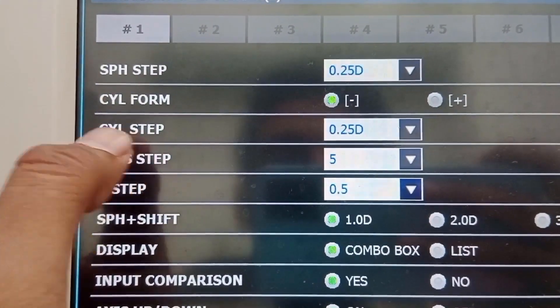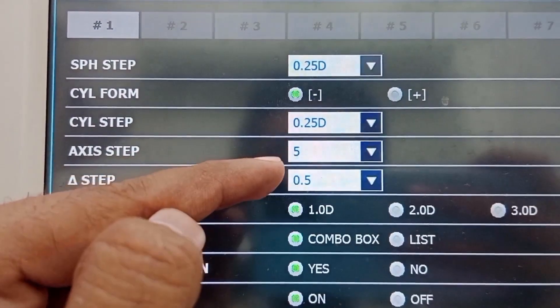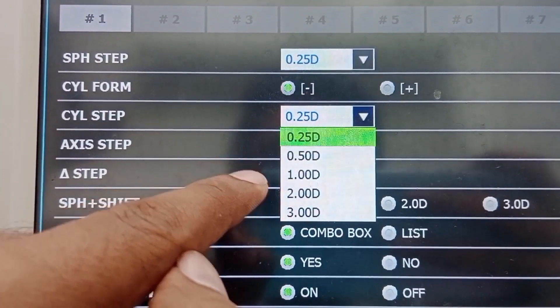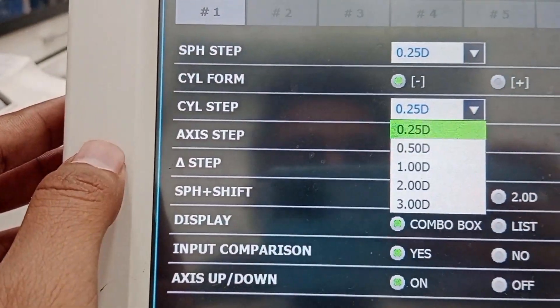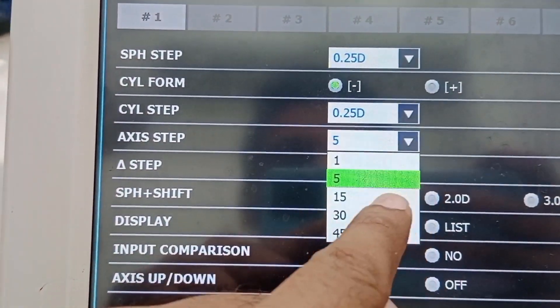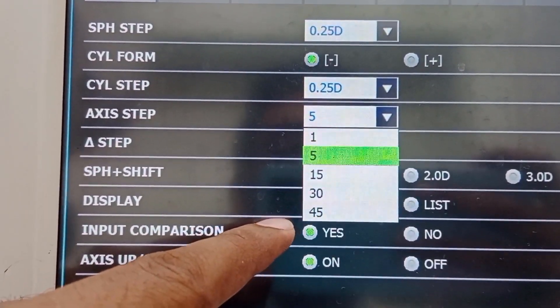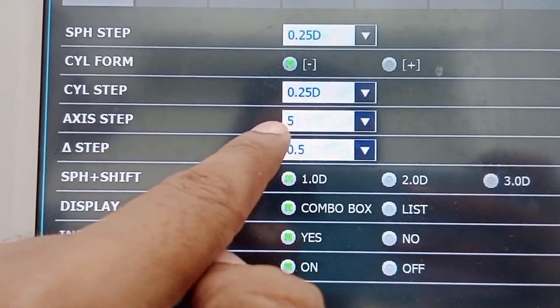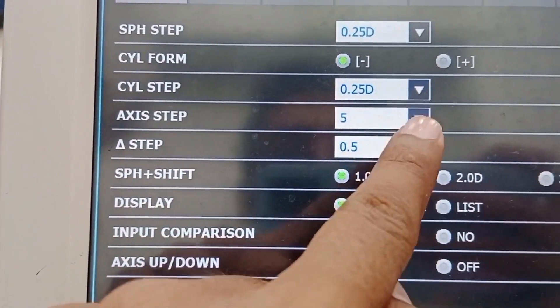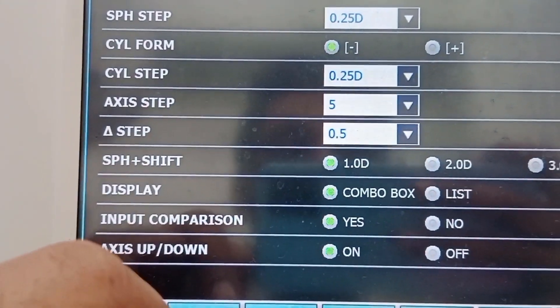Minus cylindrical form is always preferable. The next one is cylindrical step — you want to change your cylinder with 0.25, 0.5, 1, 2, or 3 diopters. The next one is axis step — with one click the axis will be changed by 1, 5, 15, 30, or 45 degrees; 5 degrees is suitable. The next is prism step — you want to change the prism with 0.5, 1.0, 2.0, 0.1, or 0.2.